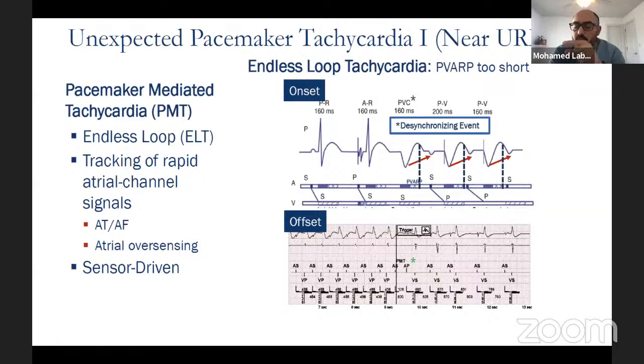Excuse me, let me comment about that, Yusuf. So actually, I'm not aware of this paper, but the guidelines are not very clear in this situation. Actually, it doesn't recommend one way or another. I agree if you think the patient will be needing pacing in the RV all the time, you might start with BiV pacing and reevaluate the ejection fraction. But jumping on someone who just had an anterior MI and low EF, who just got reperfused, and you go straight to pace him with an ICD.